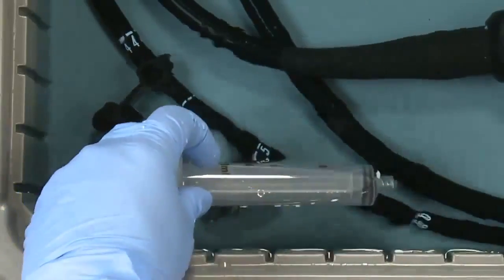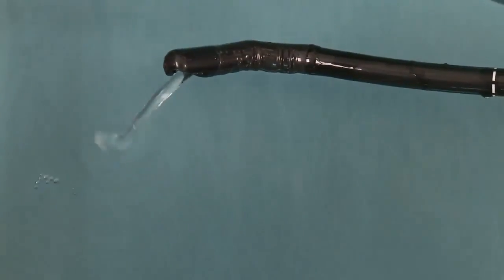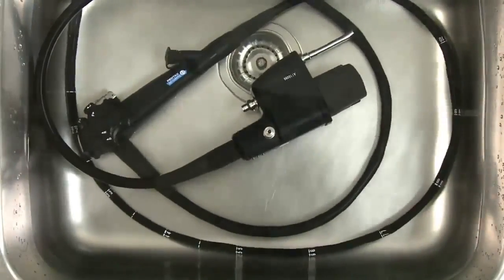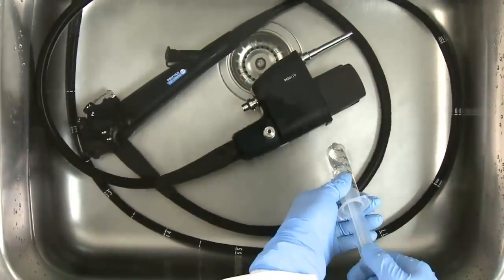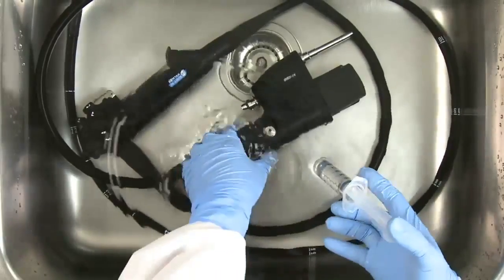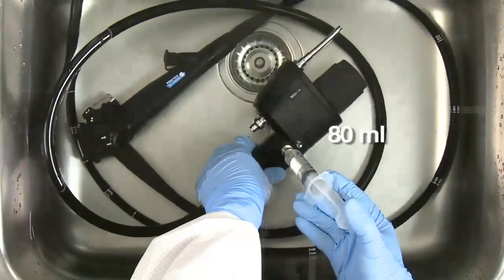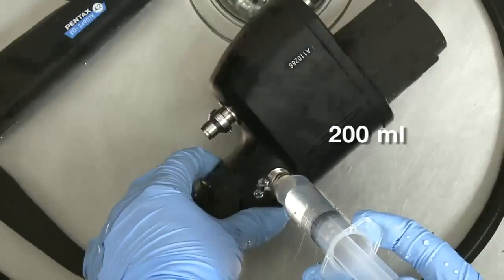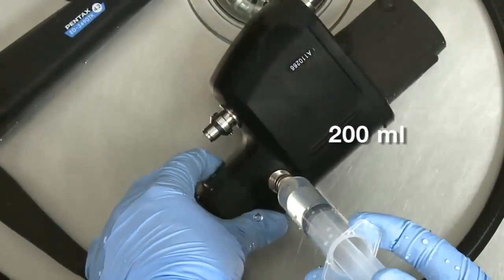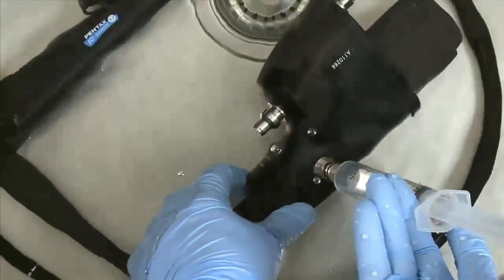After soaking, reattach all cleaning adapters and purge the disinfectant from all channels with air. Thoroughly rinse the exterior and all channels with sterile or bacteria-free water. Using a 60 cc syringe, flush the air-water channels with 80 milliliters of water and flush the suction channel with 200 milliliters of water. Upon completion, purge all channels with air until no water is visible exiting the channels.